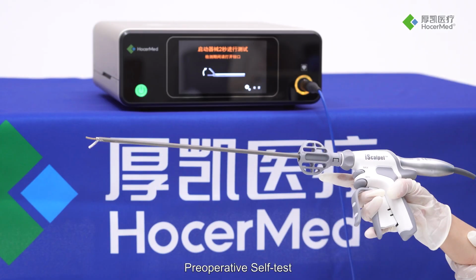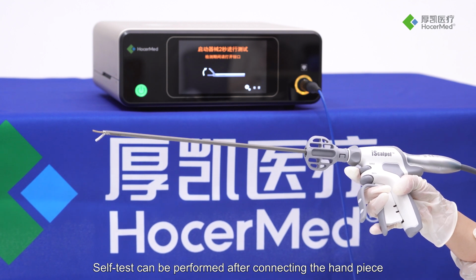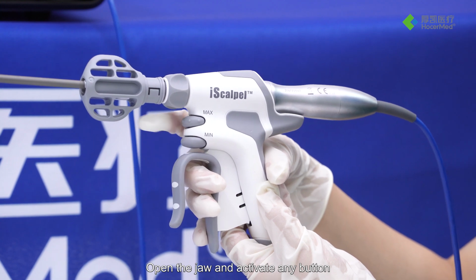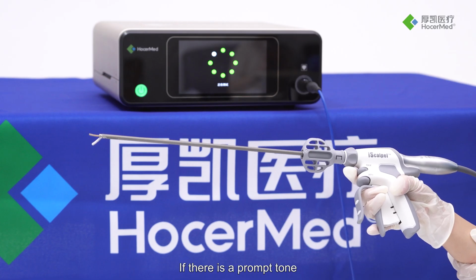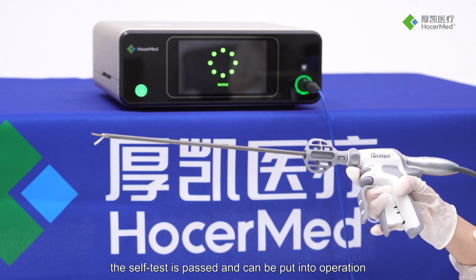Preoperative self-test. Self-test can be performed after connecting the handpiece. Open the jaw and activate any button. If there is a prompt tone, the self-test is passed and can be put into operation.